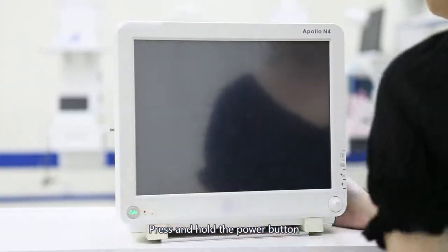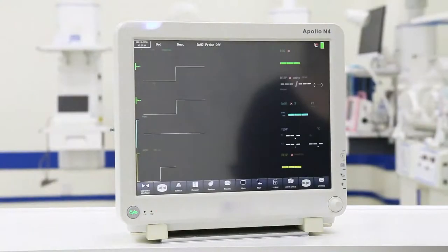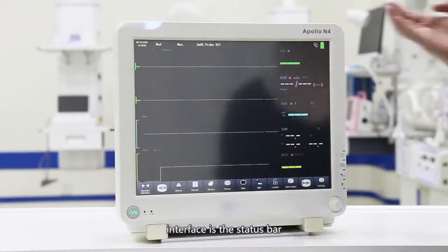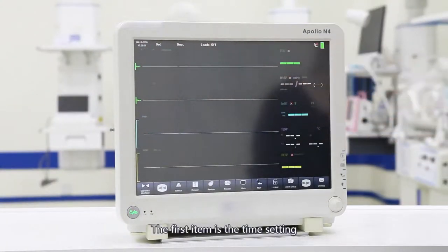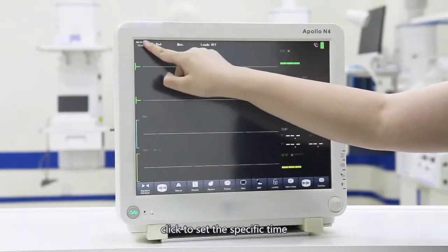Press and hold the power button for 3 seconds to start the monitor and enter the operation interface. At the top of the interface is the status bar. The first item is the time setting; click to set the specific time.